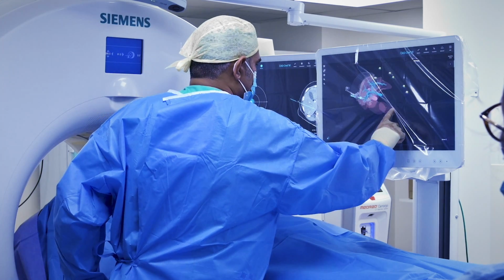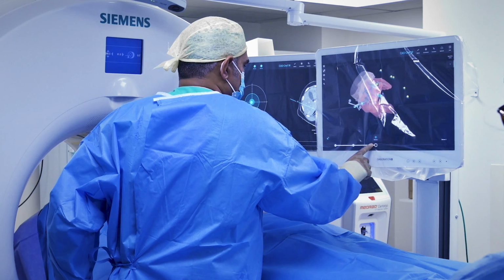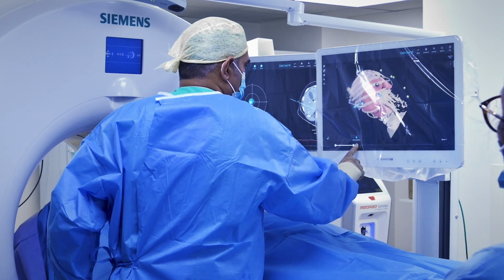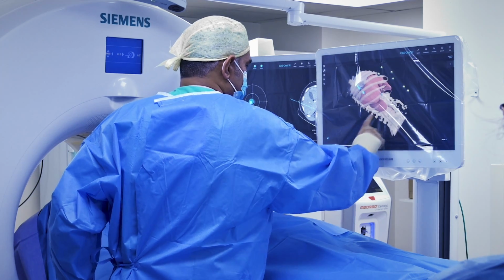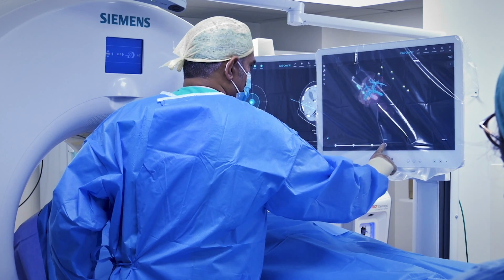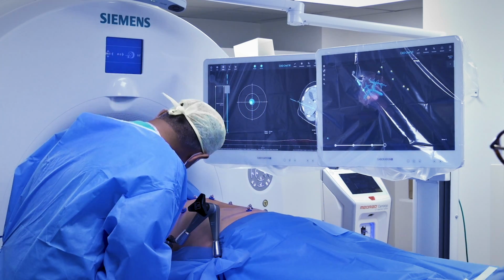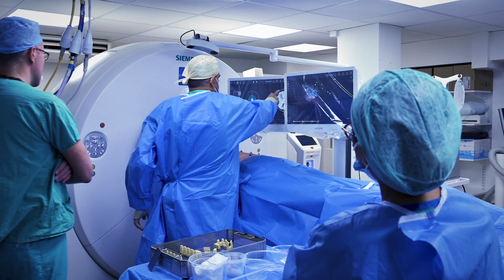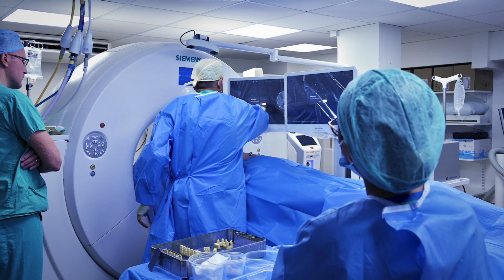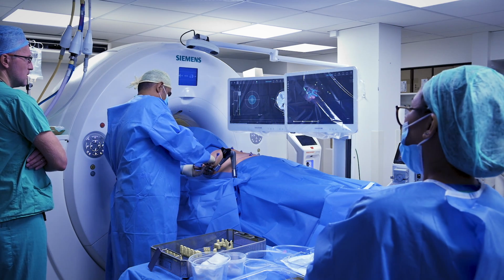So I'll just check again that I'm happy, I'm not hitting anything important, not going through any structures, either vascular or bony. I'm away from the pleura, so having the lungs potentially visible is also useful. Okay, so 16.7. 16.7. Breathing on, please, thanks. I think we're happy with that.